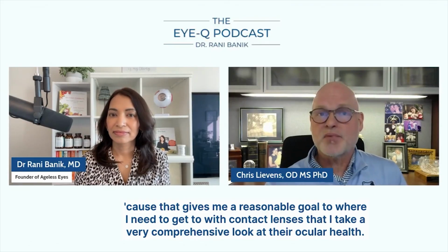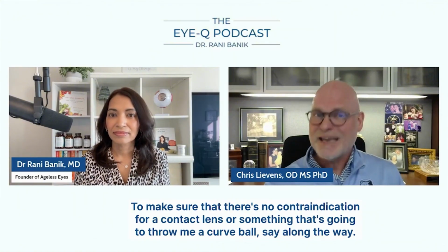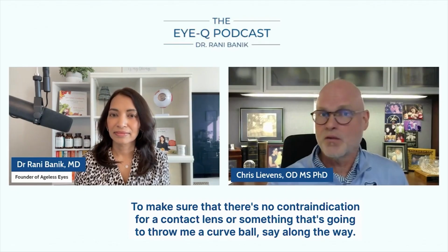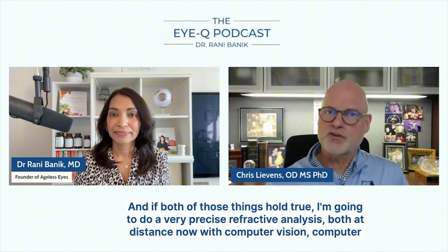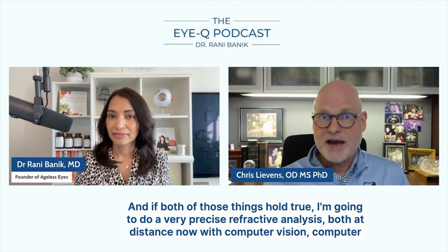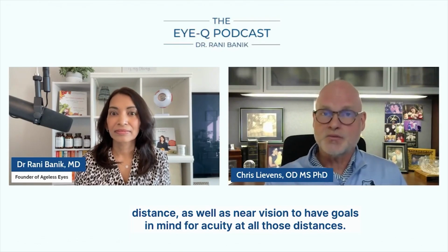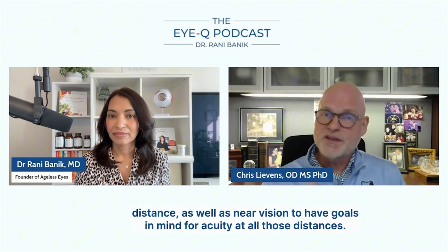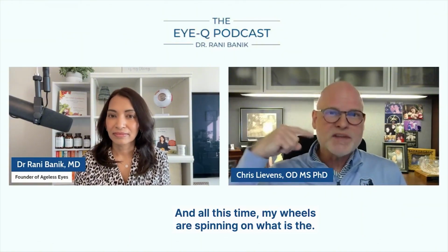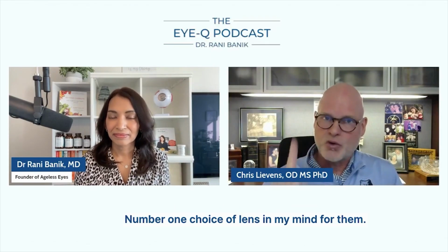Then I take a very comprehensive look at their ocular health to make sure that there's no contraindication for a contact lens or something that's going to throw me a curveball along the way. And if both of those things hold true, I'm going to do a very precise refractive analysis, both at distance, now with computer vision, computer distance, as well as near vision, to have goals in mind for acuity at all those distances.